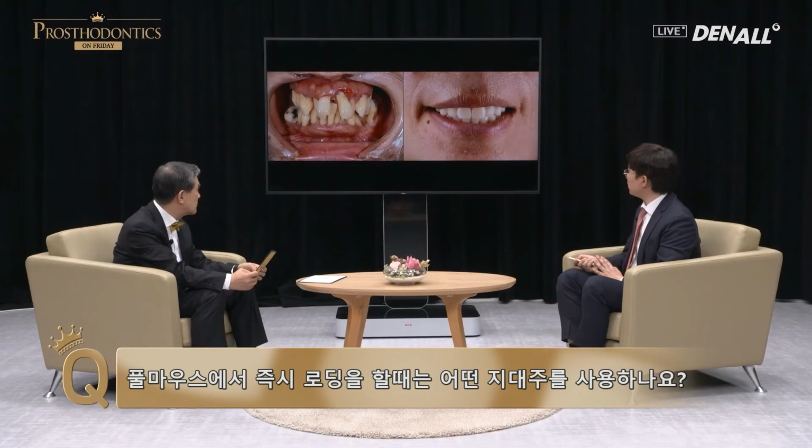If it is loaded without cement, it would be better. So recently, for immediate loading, I don't fabricate the prosthesis at the same time. Multi-unit abutments are used, and without a model, it is loaded digitally.